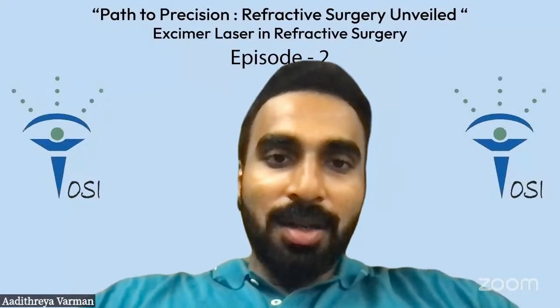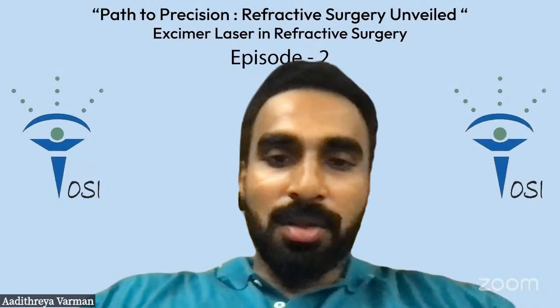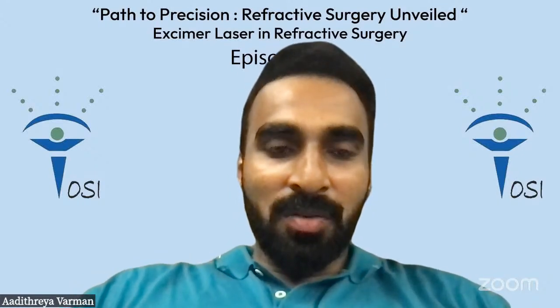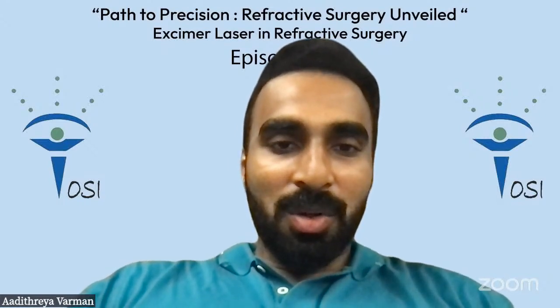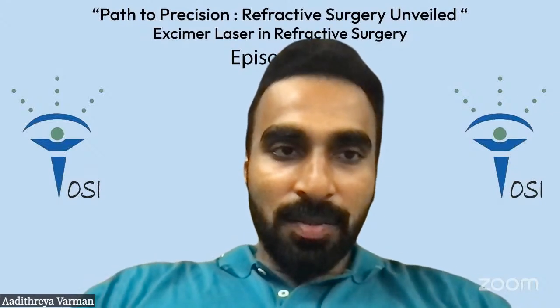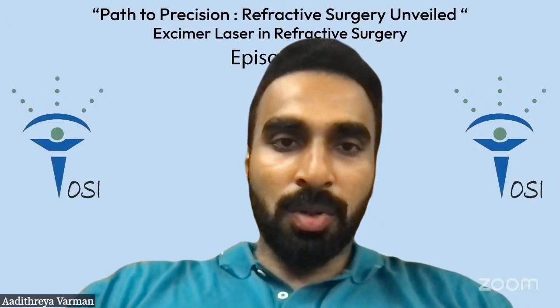I think that was absolutely amazing, as is consistent with all talks that we hear at Narayana Nethralaya. There's always something so innovative coming up that we've not even thought about. So I'd just like to comment on the role of corneal biomechanics and the Corvis. It's very interesting because I do believe that we are sometimes missing things by just doing corneal topography alone.